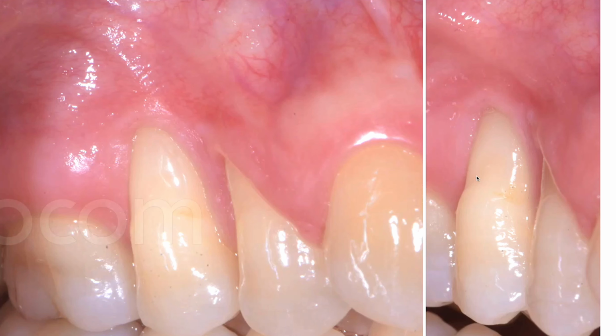Remember that we spoke about the relationship or ratio between vascular surface, which is the area of the papilla coronal to the cement enamel junction. How much vascular bed you have coronal to the cement enamel junction in this patient compared to the avascular surface that you have to cover. So this is a case in which there is no way to achieve complete coverage.